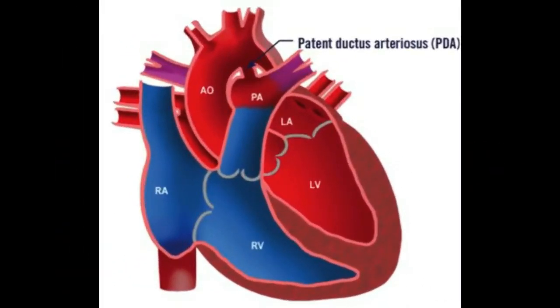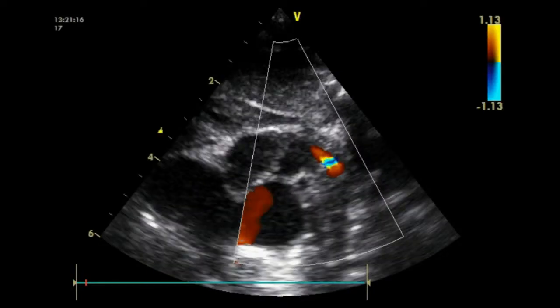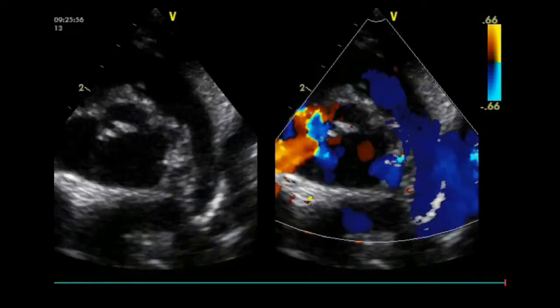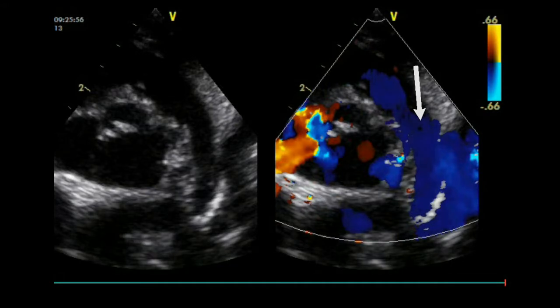The direction of the shunt across the PDA can be right-to-left, bi-directional, or left-to-right. In order to document it, color Doppler is required. A right-to-left shunt across the PDA is more difficult to see. Color Doppler will show a flow going from the pulmonary artery toward the descending aorta; thus, both great arteries and the DA will appear blue on color Doppler, because the blood moves away from the transducer.